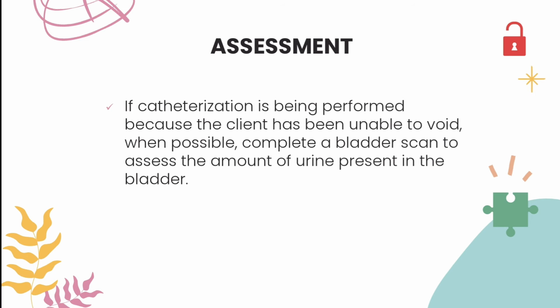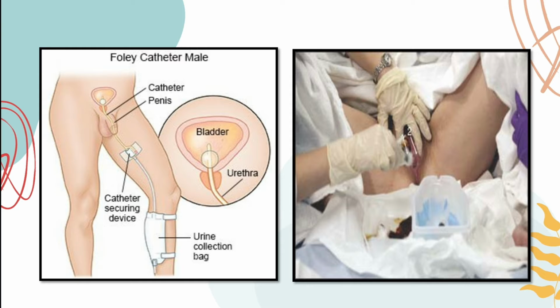If catheterization is being performed because the client has been unable to void, when possible, complete a bladder scan to assess the amount of urine present in the bladder. Next, we have the implementation.